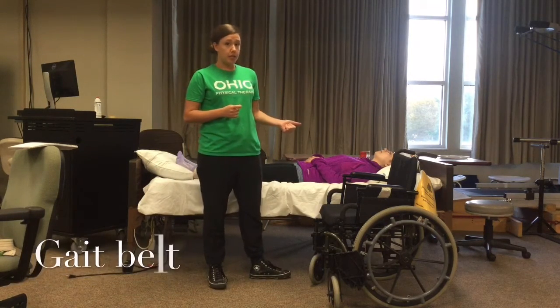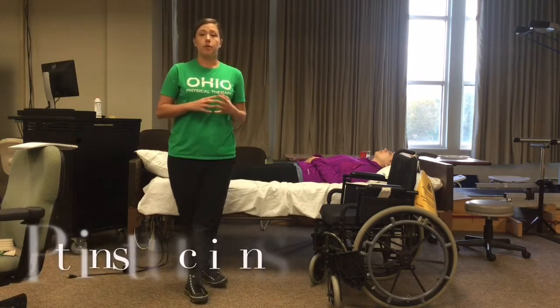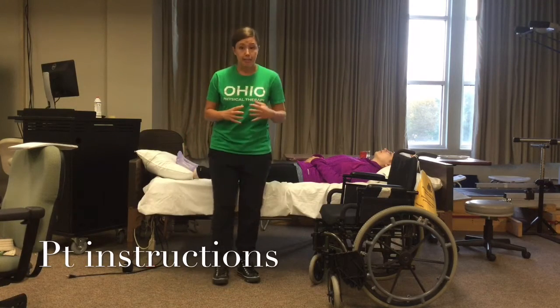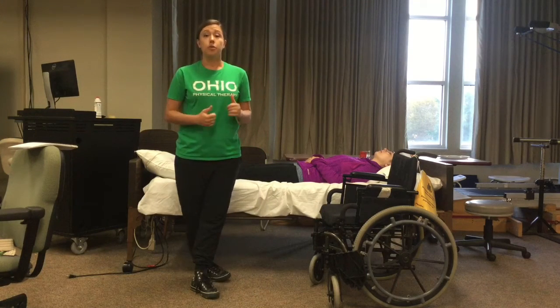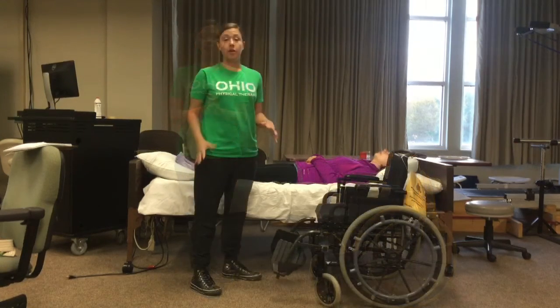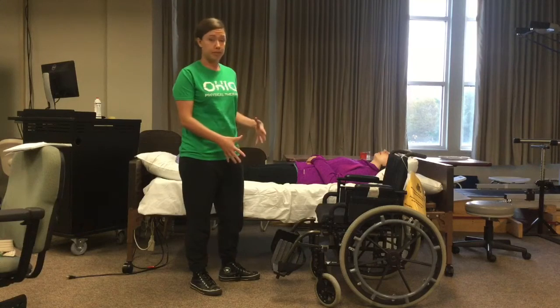Gait belt should be secured properly in this skill, and you also want to make sure that you're providing the patient with instructions. So that can include actually demonstrating the skill and also explaining what cues you're going to give them. I'm going to say 1, 2, 3, up, pivot, and I'm going to explain that to her later when I perform the skill.